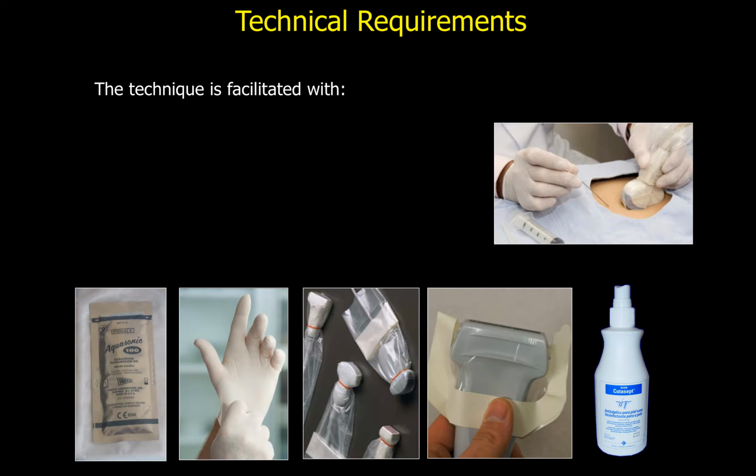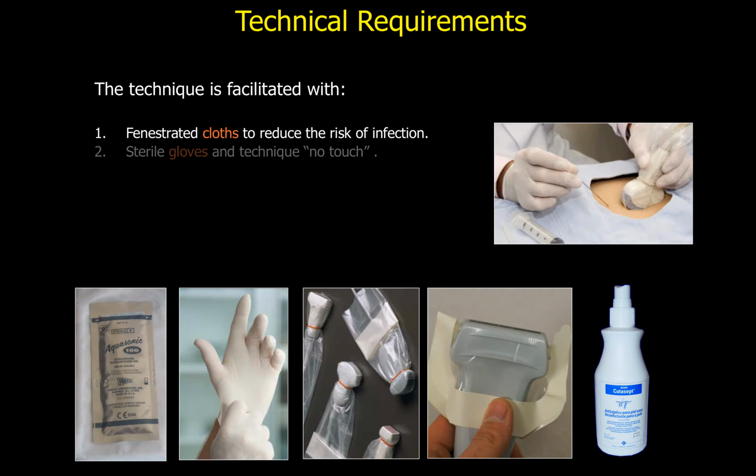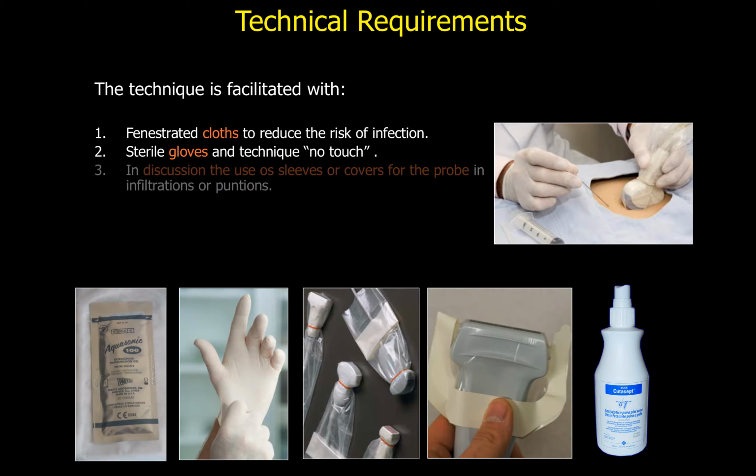The technique is facilitated with fenestrated cloths just to reduce the risk of infection. We need sterile gloves and the no-touch technique. The use of sleeves or covers for the probe is always under discussion. We don't use them very often.